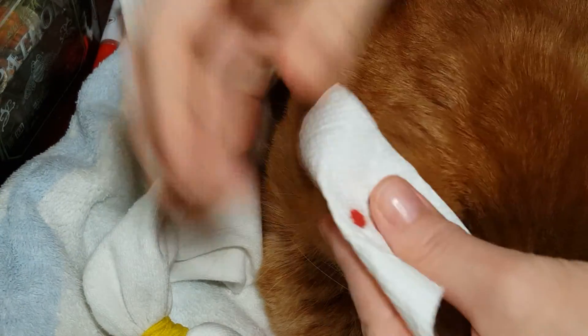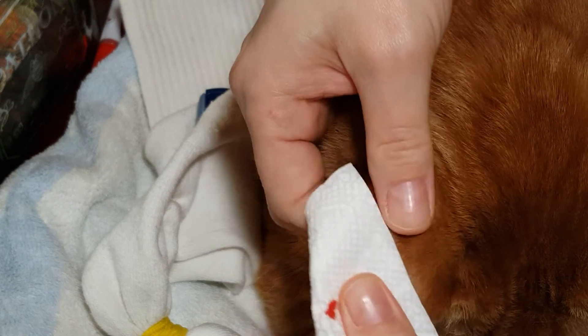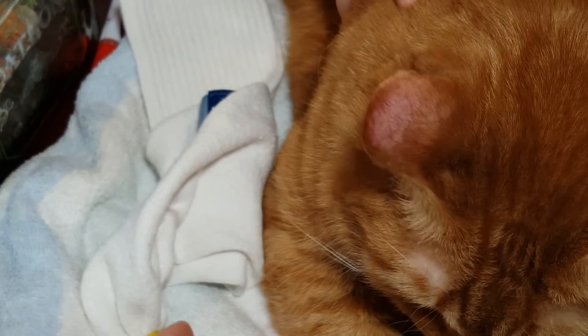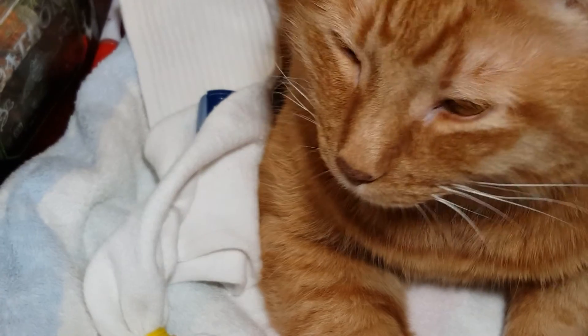Have a napkin ready. It was that quick and easy. The warm sock makes a world of difference. I hope that this has helped — that's it. It just has to be a little easier.